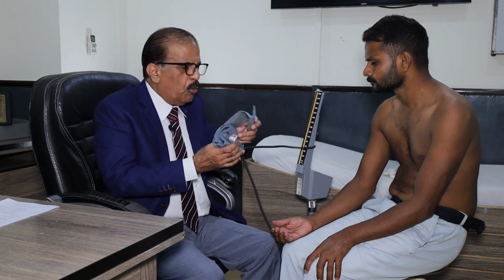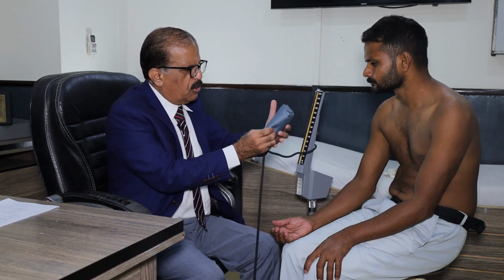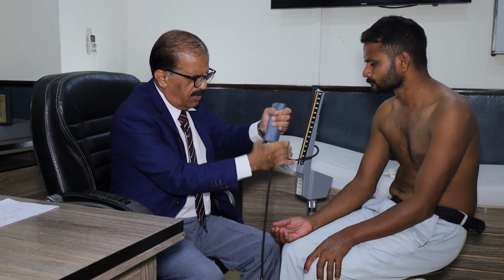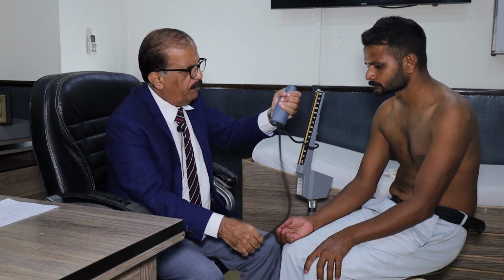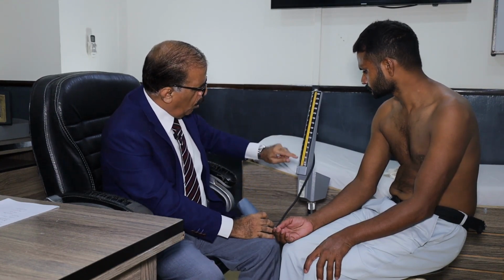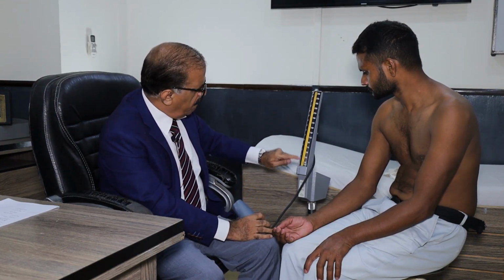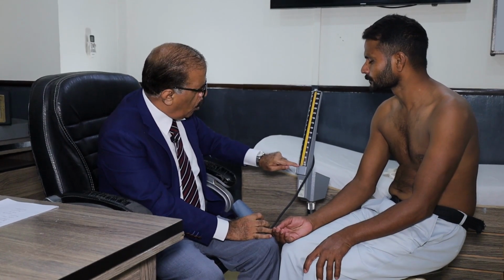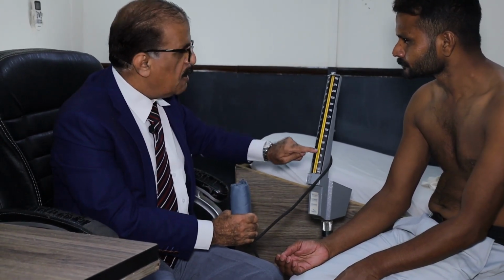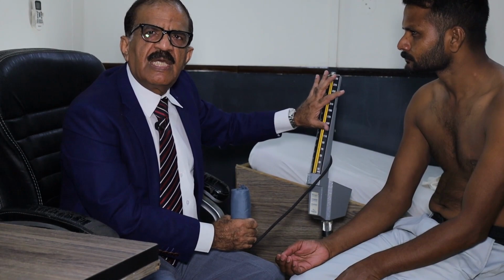So there are two methods. One is palpatory, the other is auscultatory. First, let me demonstrate the palpatory method. For both you need this apparatus. So this is the cuff. It needs to be deflated. You do it like this. You press it, you of course open it from here and deflate. It should have no air before you apply. And this column should be at 0. So in this type of blood pressure apparatus, if the mercury column is at 0, and when you inflate, the column doesn't break, that means this instrument is calibrated.